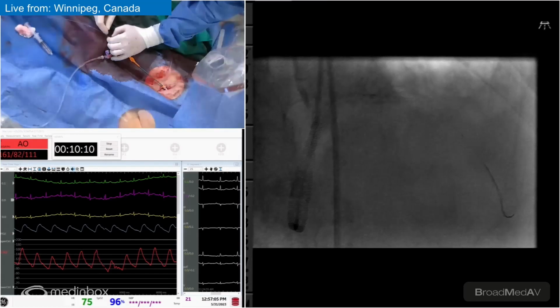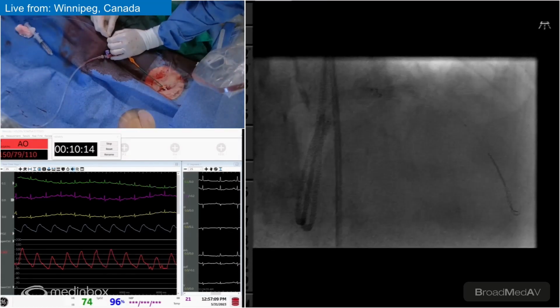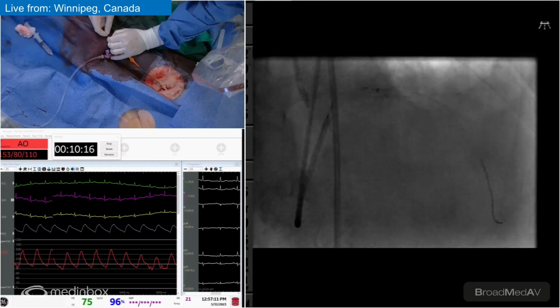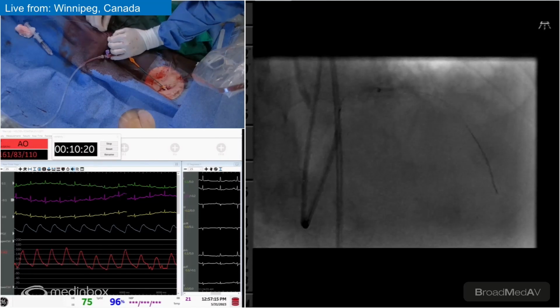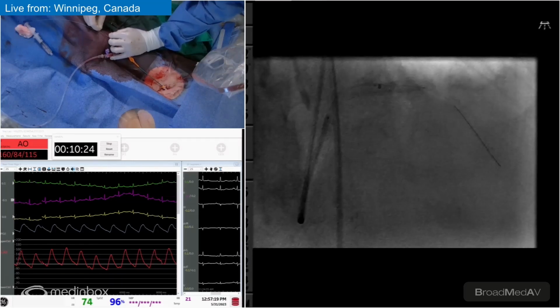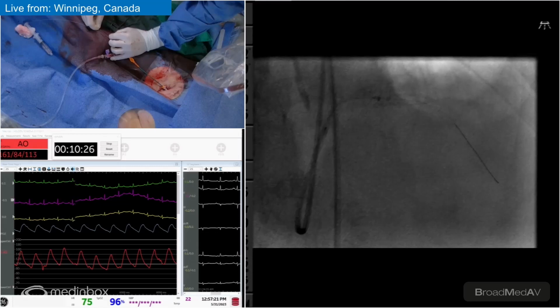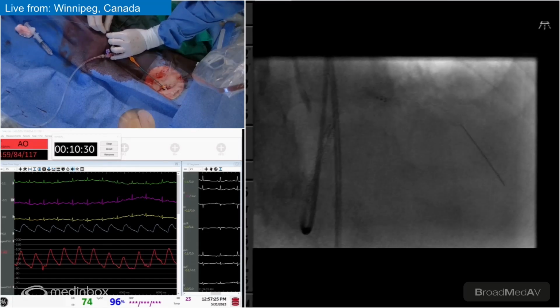You might need to pull back on the wire here. Yeah, some sort of traction because you're in the stent. That's bizarre, isn't it? I think the angle coming off the left main is pretty angulated. It doesn't want to track within the guideliner because of its stiffness. Get the guide up a bit better.